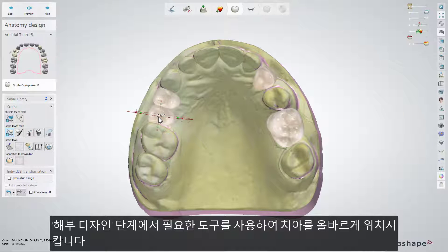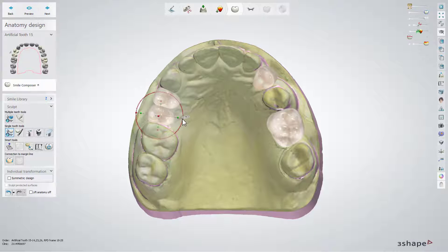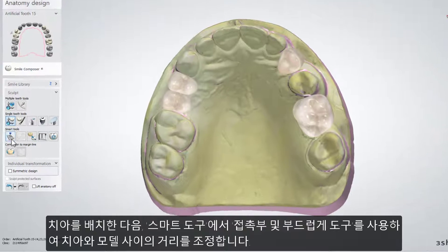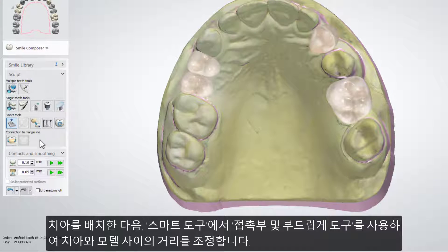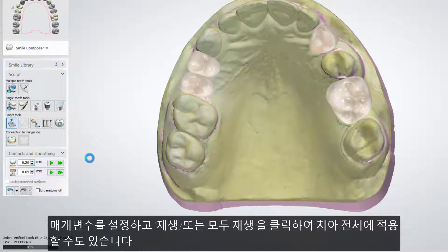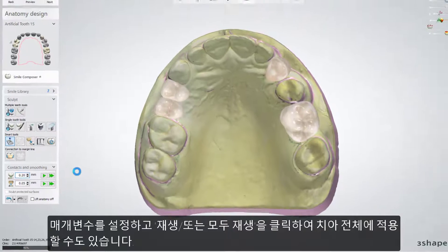While at the anatomy design step, place the teeth in the correct position. Use all the available tools to do so. After placing the anatomy from the smart tools, use the contact and smoothing tool and adjust the distance from the anatomy to the model. Do this by setting up the parameter and pressing play or play to all to apply it globally for all the teeth.